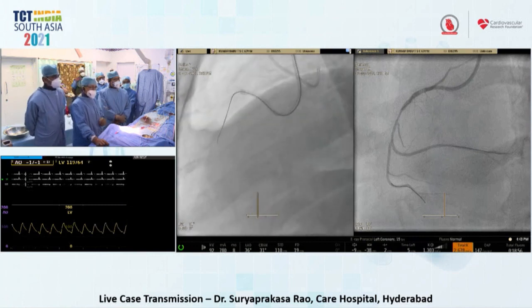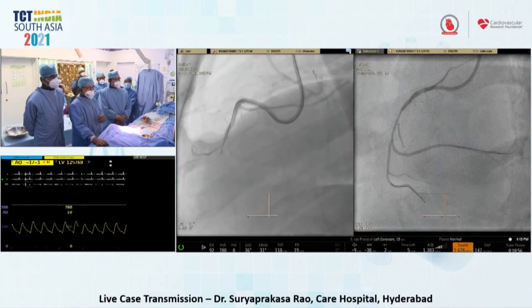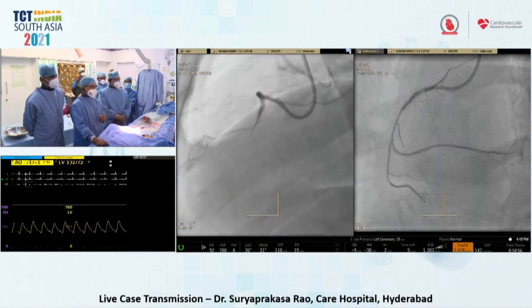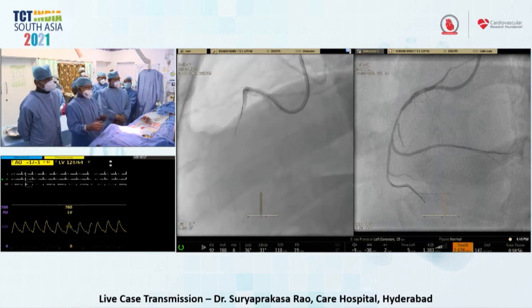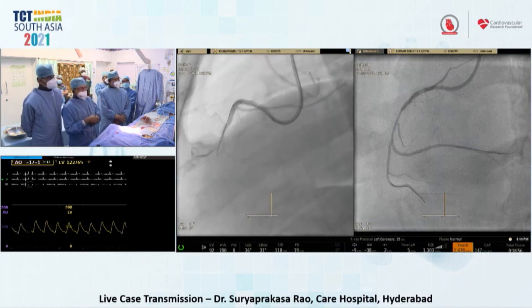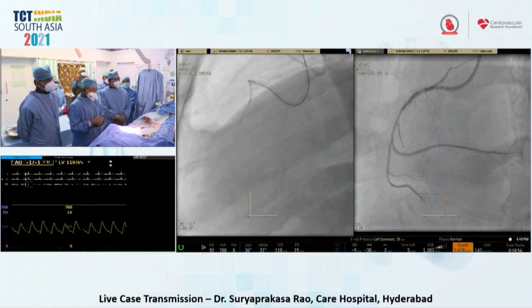We can take advantage of balloon anchoring, and we can even place an Eagle Eye catheter, but there is an ostial stenosis, so IVUS guided puncture may be difficult in this case. But as Kapardhi told, initially there may always be invisible collaterals in your channel. So we opted for soft tissue tracking, as most of the Japanese feel. Then you can escalate the wire.